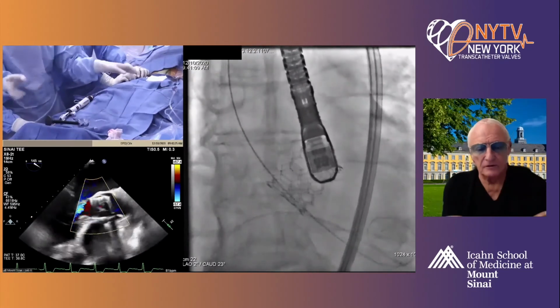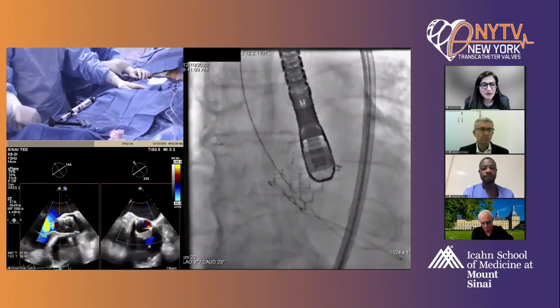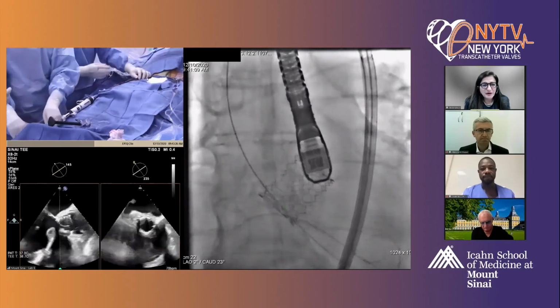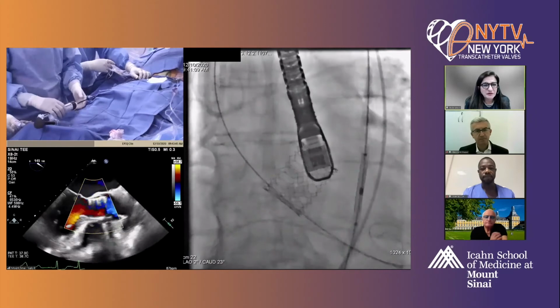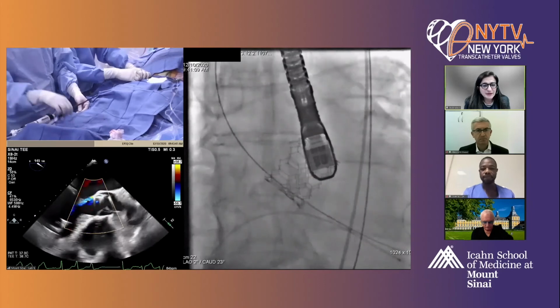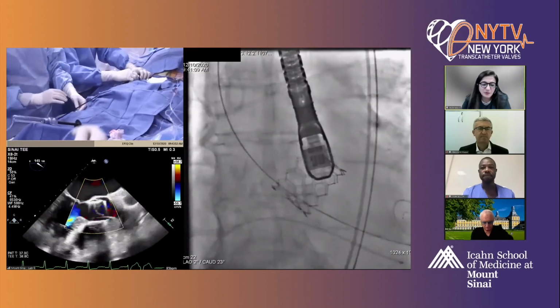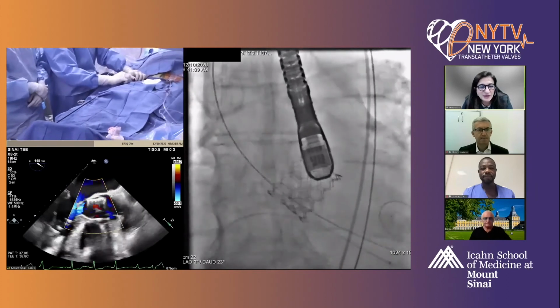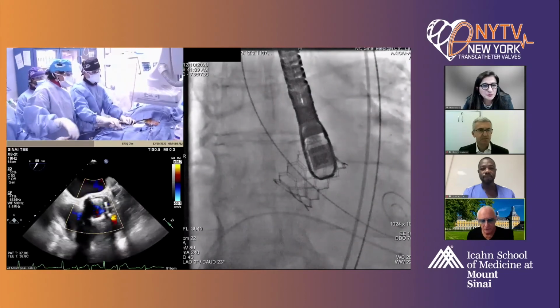Yeah, and I think that's what Didier was saying, that based on the CT, Dr. Kinney, it may be that you will not be able to get this paravalvular leak gone just based on the way the valve is positioned and the configuration of the valve and the configuration of the supraannular ridge by CT. You did your best, you went up a little bit, you post-dilated, you gave a couple more cc's, and what he's saying, and I think the rest of the panel are agreeing, is that you're not going to get rid of this little mild leak. Do the aortogram now.